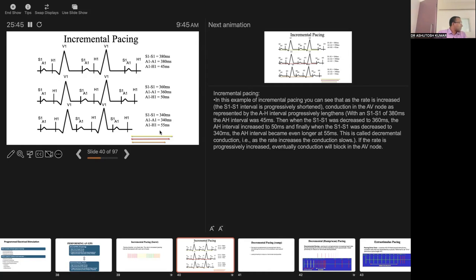Jump, what you are saying, na? Sir, jump आया. Book में it is not written. So that's why everybody starts struggling when they come in the cath lab. Jump क्या बोल रहे हैं, block क्या बोल रहे हैं. So where to see, you should know.